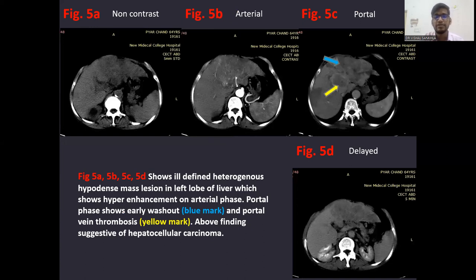This case shows multiple ill-defined heterogeneous hypodense mass lesions in the left lobe of liver, which show hyperenhancement on arterial phase. Portal phase shows early washout and portal vein thrombosis. These above findings are suggestive of hepatocellular carcinoma.